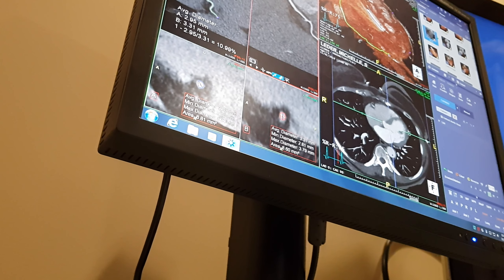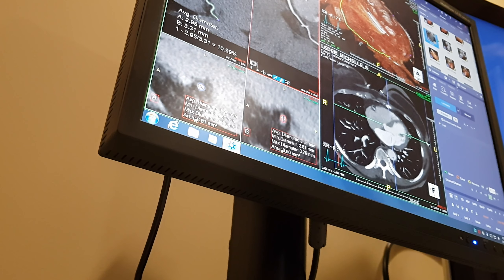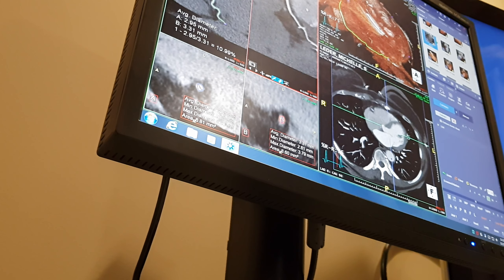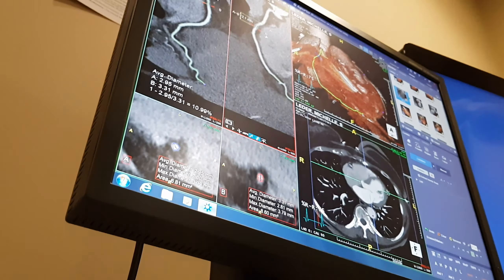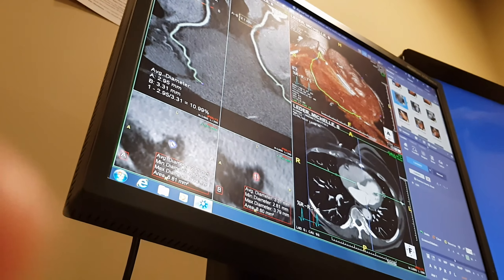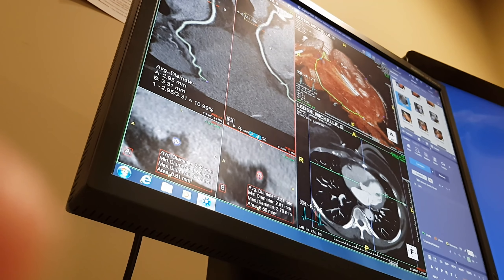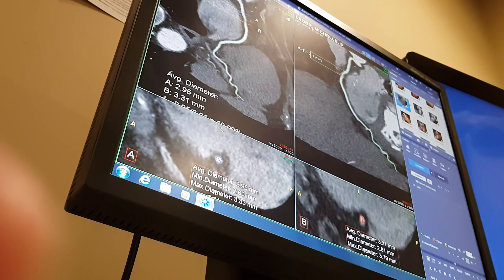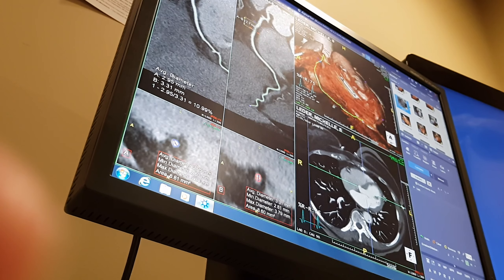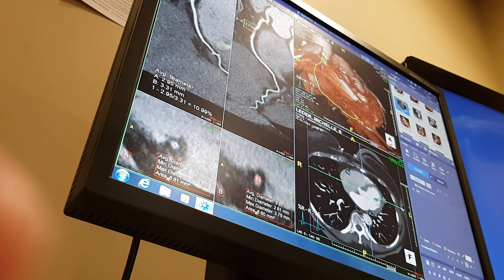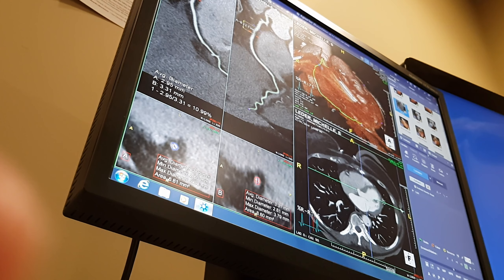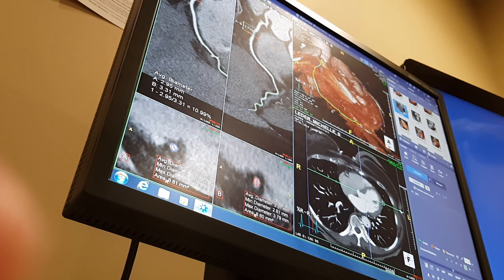It has a little indentation. That's a little mild non-calcified plaque — that's like the mild beginnings of heart disease. But there's no calcification. If we want to look at the other artery, we need to go back.